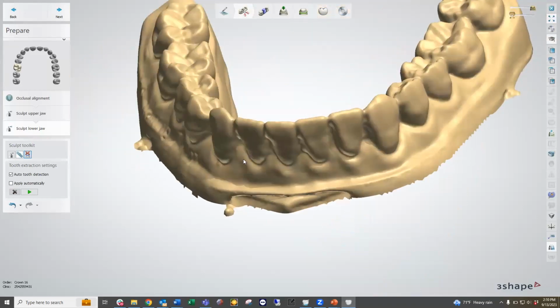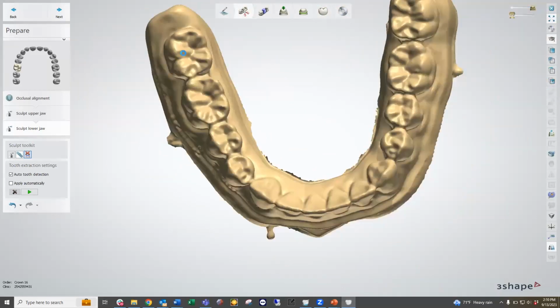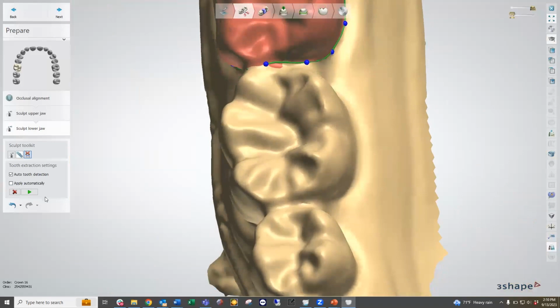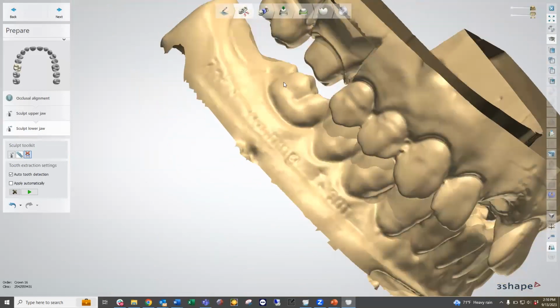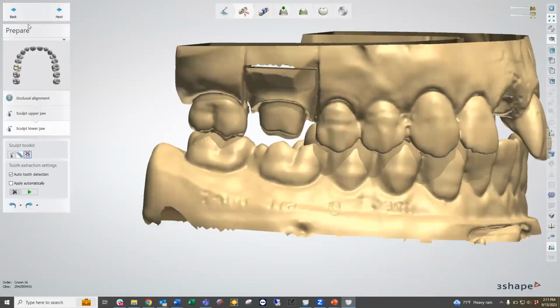And the last one that we have is the option to extract teeth. So if I didn't have this tooth or we knew that this tooth was going to be extracted, we can go ahead and click on the top. And it allows us to edit the model to assume that this one's going to be an extracted tooth during the design portion. And we can go ahead and hit apply. And that way we can utilize this function during our design, knowing that this tooth would be extracted prior to the restoration going into the mouth. But since we're not worried about that today, we're going to go ahead and undo this. This is just knowledge for future instances. If you ever have to make any sort of preparations on either arch, you have those options available to you, and you have the availability to do whatever you would like to do within the models.